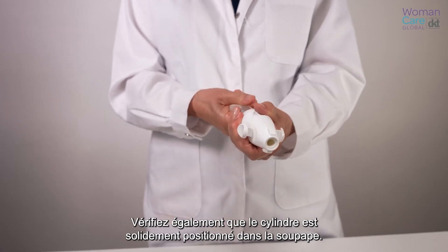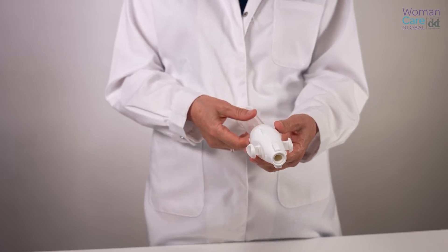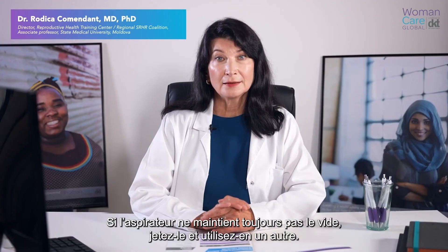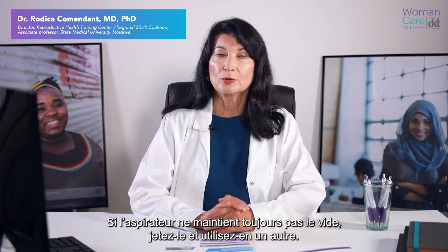Also, make sure that the cylinder is firmly placed into the valve. Then create a vacuum and test it again. If the vacuum is still not retained, the aspirator should be discarded or replaced with a new one.